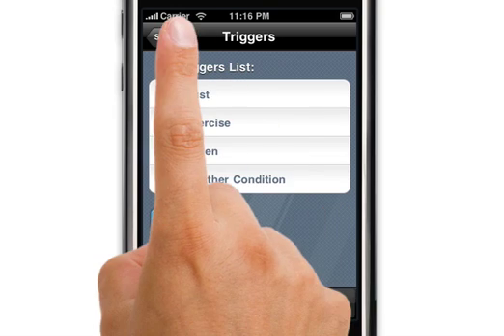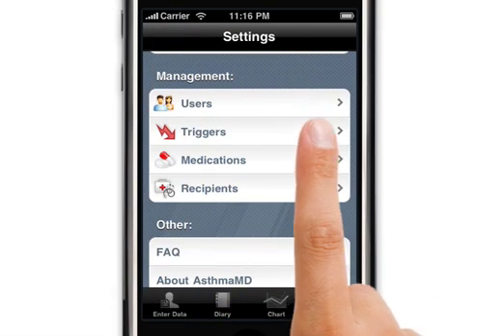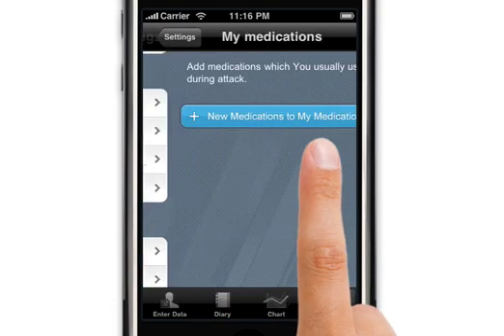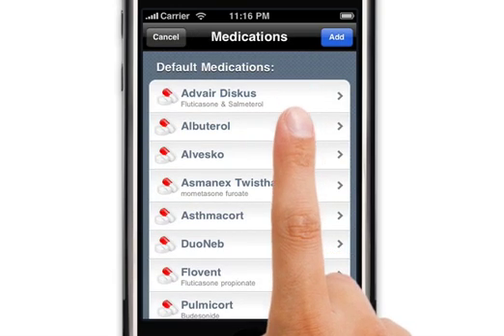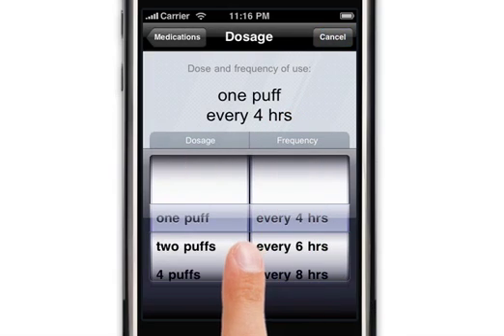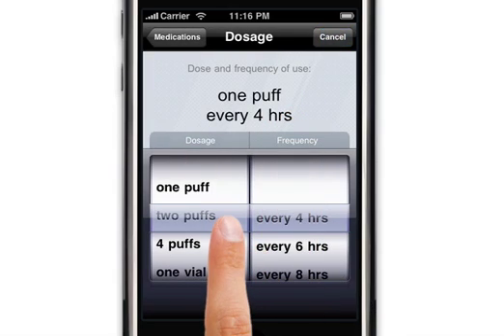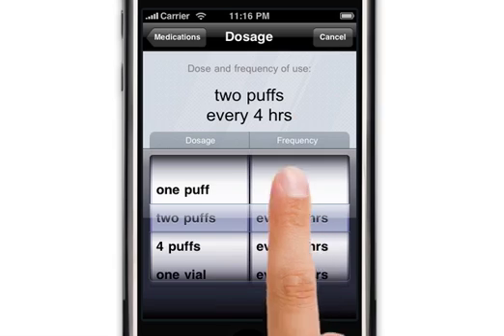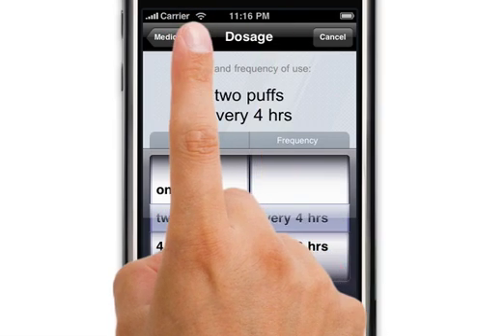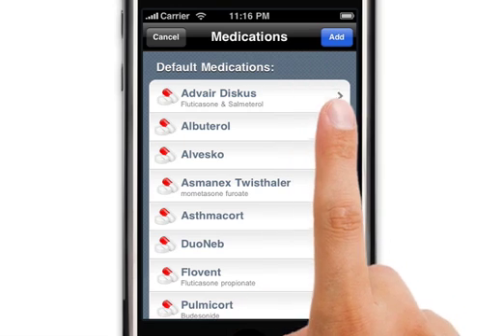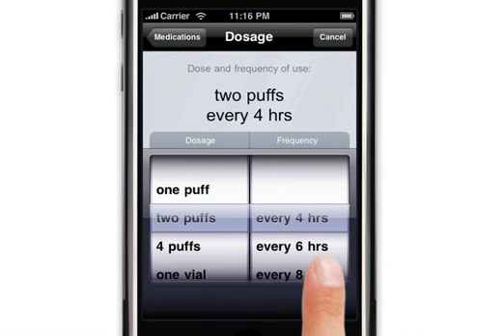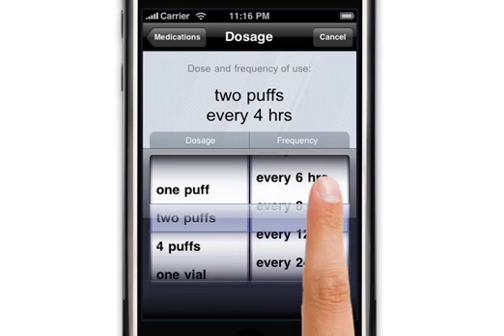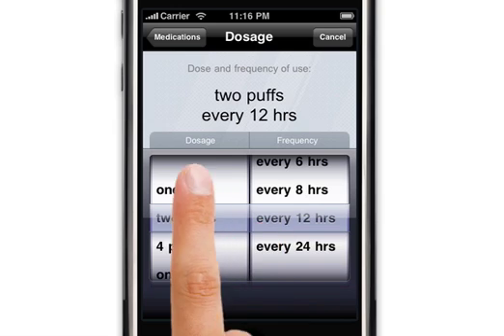Now you can see the list of triggers, and you can choose those later on as needed. For medications, you can do the same thing by adding a medication prescribed to you by your physician. After clicking each medication, you can choose the dosage and the frequency. You can repeat this with every medication that has been prescribed to you. You only have to do this process one time, and the application will remember your choices.